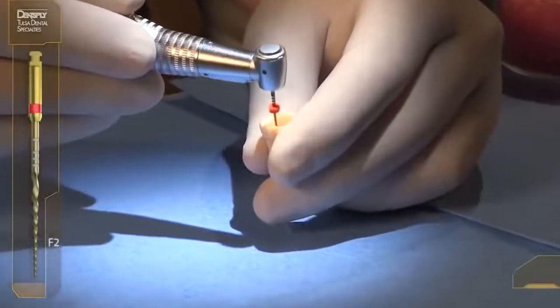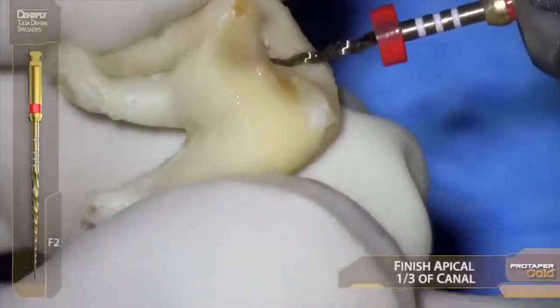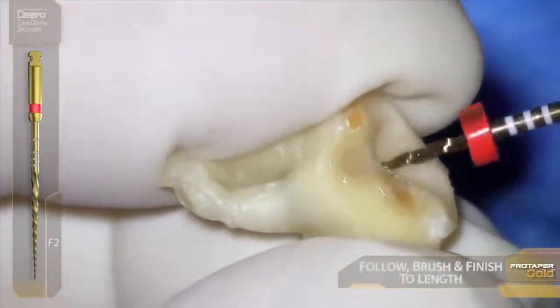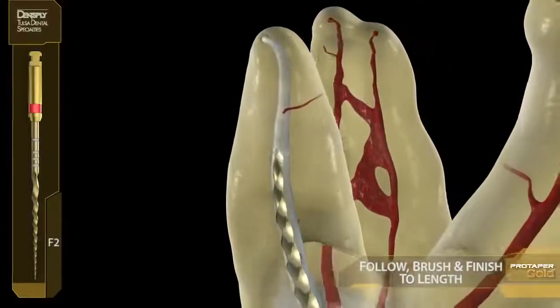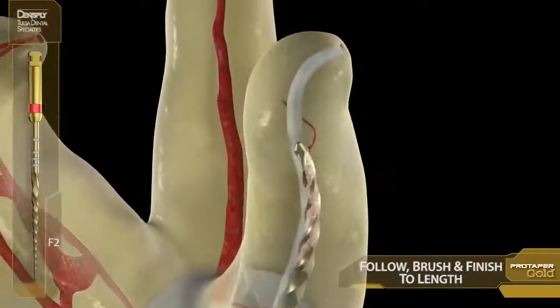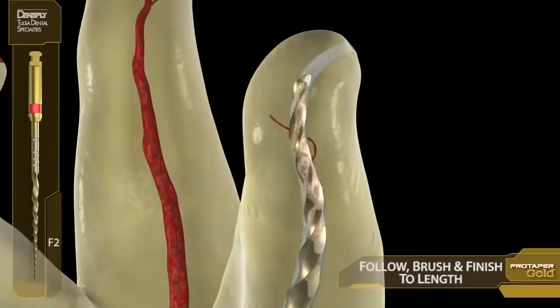This is our cue to progress with F2. The watchwords: follow and brush, follow and brush. As you're experiencing ProTaper Gold finishers particularly, you begin to understand the mastery of pace, rhythm, and flow.